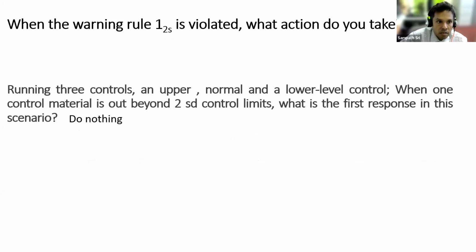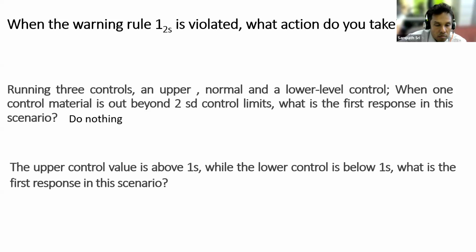The next question was, when the warning rule 1-2S is violated, what actions do we need to take?